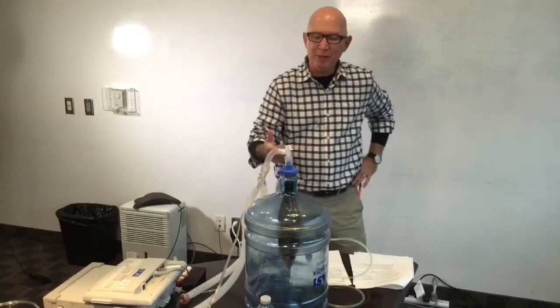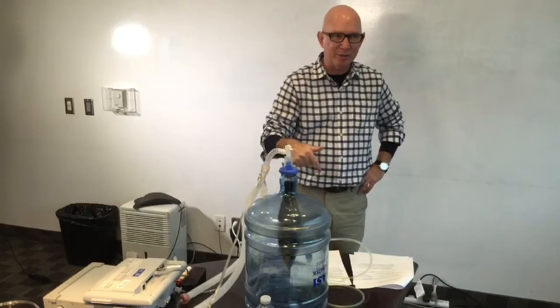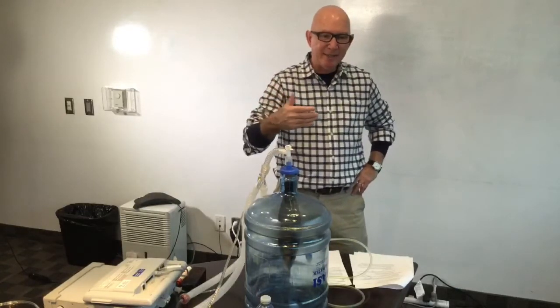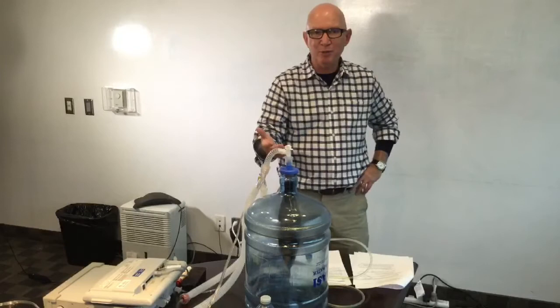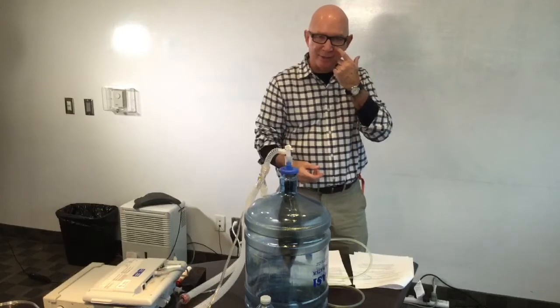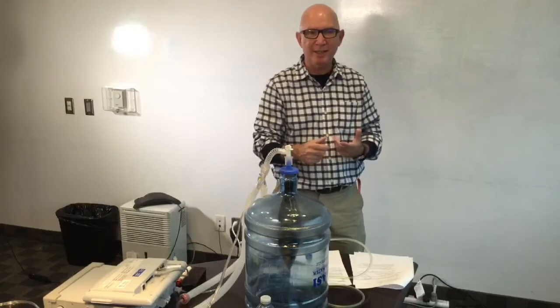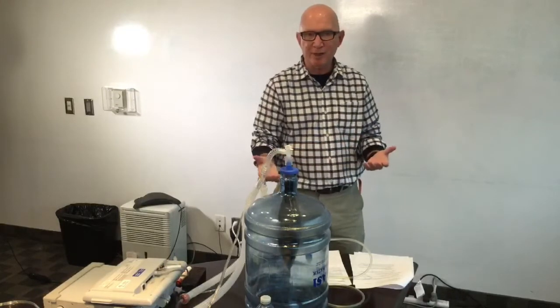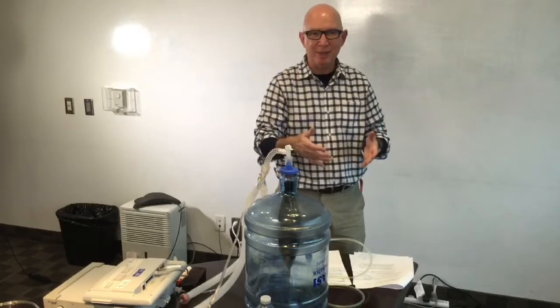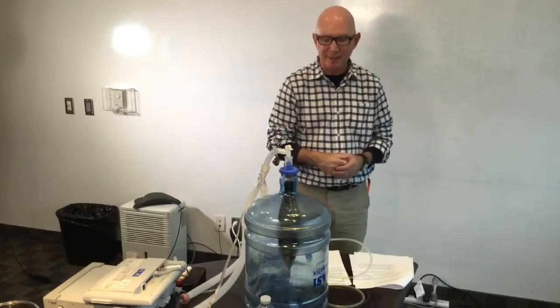Keep in mind as well, when you get high pressures, and I'm not suggesting that this is the case with these obese individuals, I'm making an assumption already, when the question was asked, that you've optimized some of these other things, the first go-to is always the DOPE mnemonic. So look for other reasons why the PIPs are high. But if you've ruled out all those other things, so you suction out the tube, the patient's not chewing on the endotracheal tube, there isn't a pneumothorax, the tube isn't misplaced, and it's not an equipment failure, then you need to say, well, how can I effectively ventilate this patient and minimize the pressures that are required to do that? And once you get to that point, then you have to live with that. Okay.